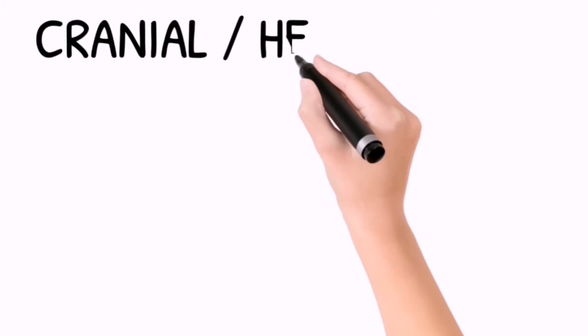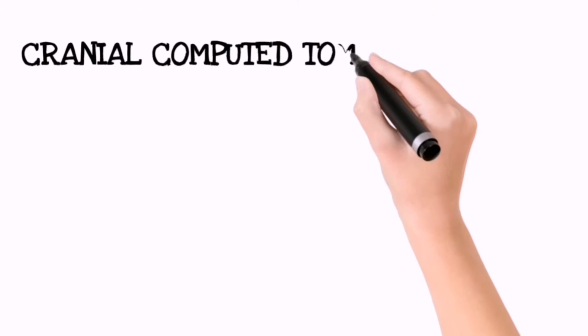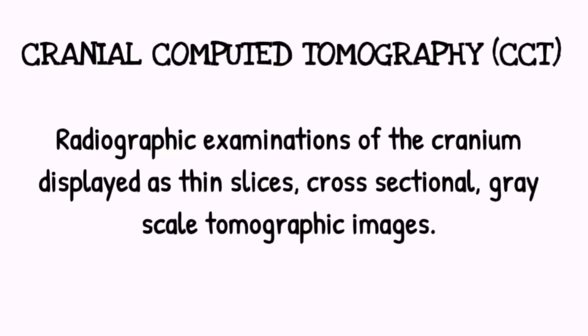For today's video, we will discuss the cranial or head CT scan. Cranial computed tomography, or CCT, is a radiographic examination of the cranium displayed as thin slices, cross-sectional grayscale tomographic images.